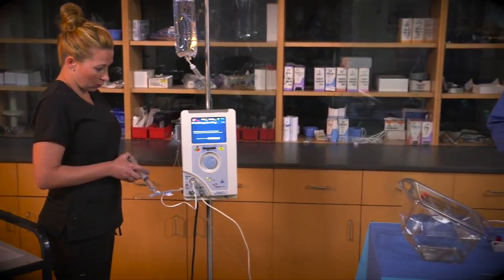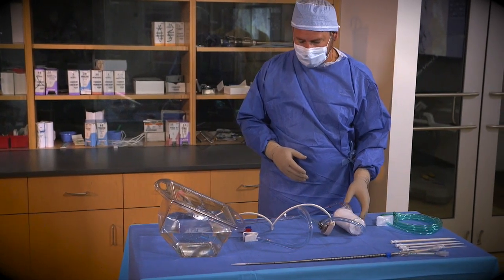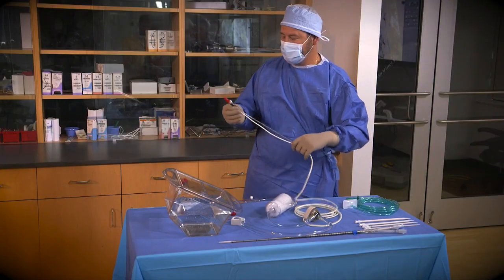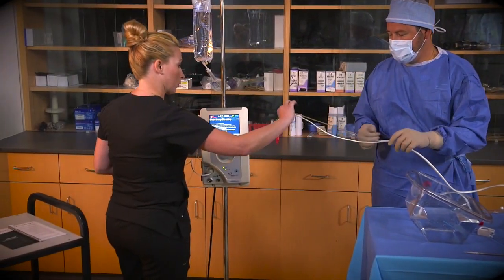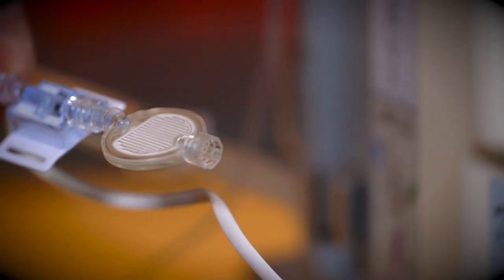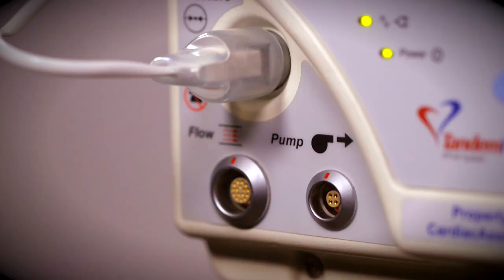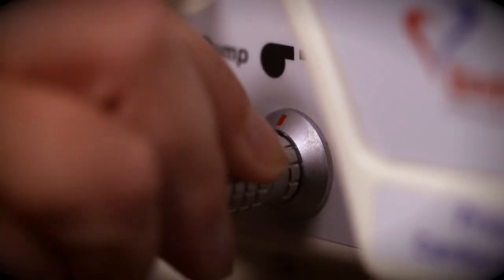Priming the Tandem Heart pump requires two people: a scrubbed or sterile operator in the sterile field, and a controller operator in the non-sterile field. The sterile operator hands the ends of the pump's external communicating line and infusate line to the controller operator. The controller operator then connects the pump's infusion line to the bacteriologic filter at the end of the infusion assembly, and connects the pump power line to the pump power receptacle located on the front of the controller.